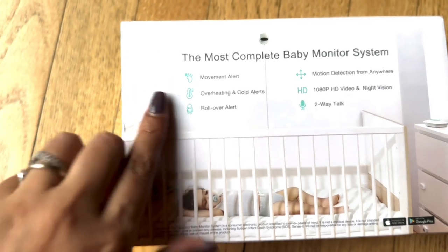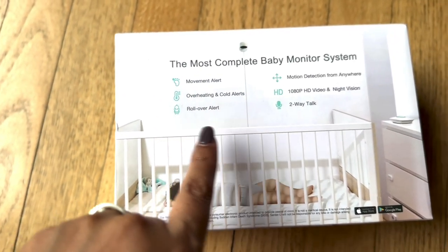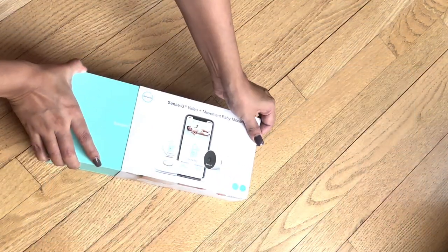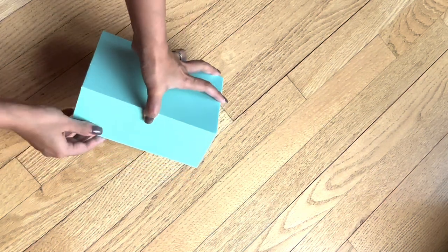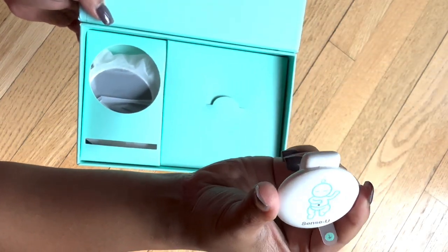This complete monitor system includes movement alert, overheating and cold alert, rollover alert, motion detection, 1080p HD video, night vision, and two-way talk. Let's unbox this to see what's inside this beautiful package — I really love the nice packaging, I'm a big sucker for good packaging.